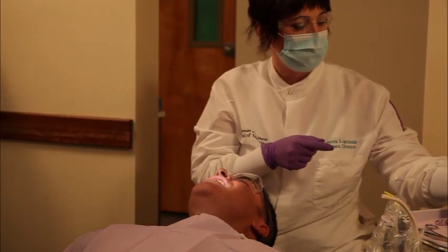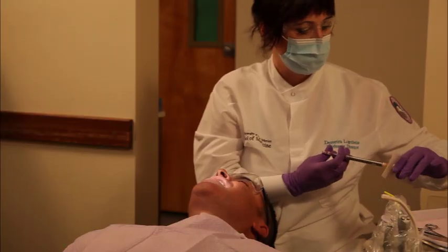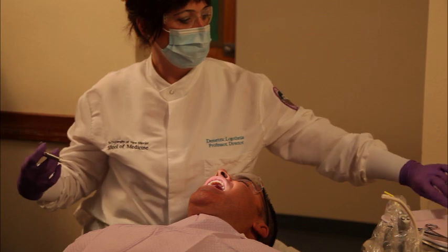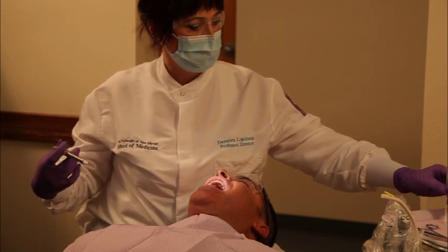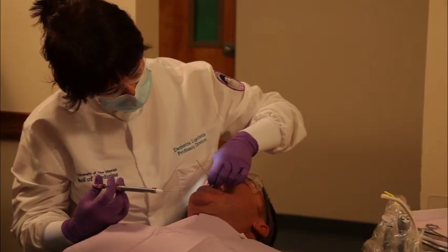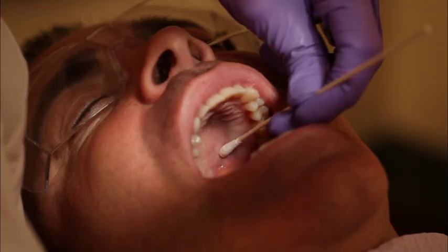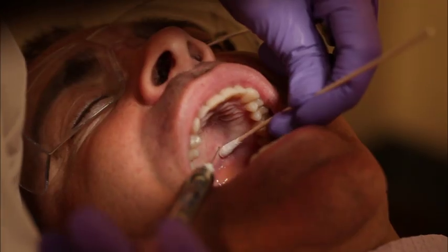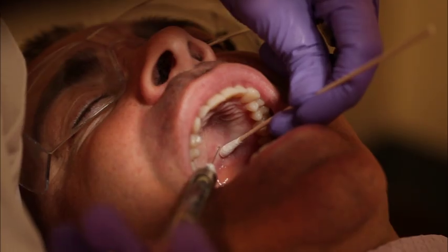Using a 27-gauge short or extra short needle with the syringe in the dominant hand, orient the bevel of the needle toward the hard palate. Establish a fulcrum that allows you the greatest stability of the syringe. Using a new cotton tip applicator in the non-dominant hand, apply firm pressure at the greater palatine foramen. The use of pressure anesthesia with a cotton tip applicator to the injection site before, during, and after the injection to blanch the tissue will reduce patient discomfort.